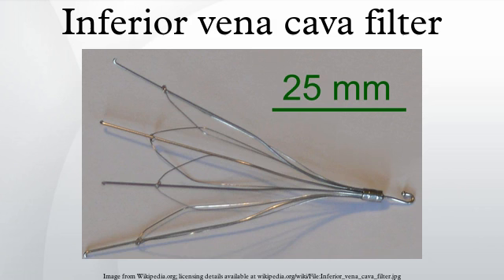An inferior vena cava filter is a type of vascular filter, a medical device that is implanted by interventional radiologists or vascular surgeons into the inferior vena cava to presumably prevent life-threatening pulmonary emboli. Their effectiveness and safety profile is not well established, and in general, they are only recommended in some high-risk scenarios.